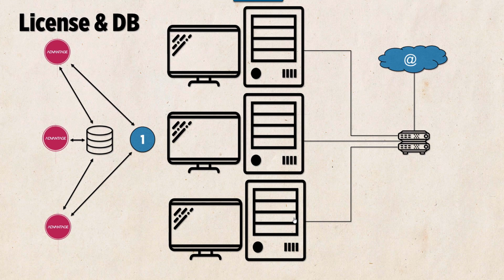So AudaxCeph license can float from one computer to another. If you have one license, it can be run on any computer in the network, but just one at the same time. When AudaxCeph is exited, the license is purged and can be grabbed by another computer, and it will work on another computer. The consequence is that you do not need 3 licenses for 3 dental chairs or 3 dentists. One will probably be enough.